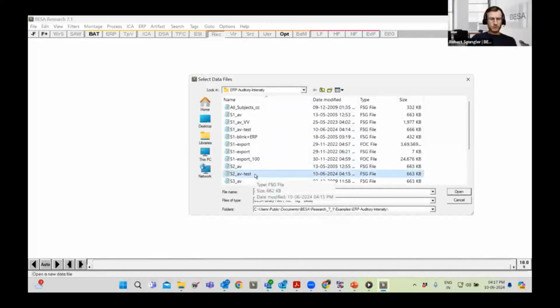Vibhin, sorry to interrupt you, there are two questions at the moment. So this one question: what's the maximum number of files that we can upload in the batch processing? To be honest, I don't exactly remember. In my studies, I've used a really large number of files. Harald, do you have this number in mind?